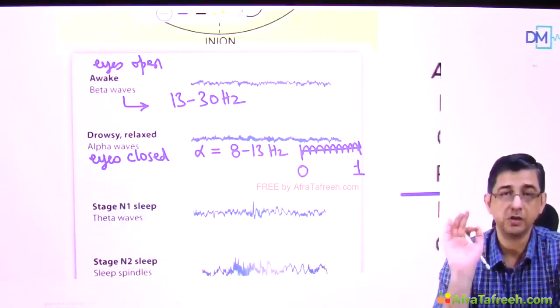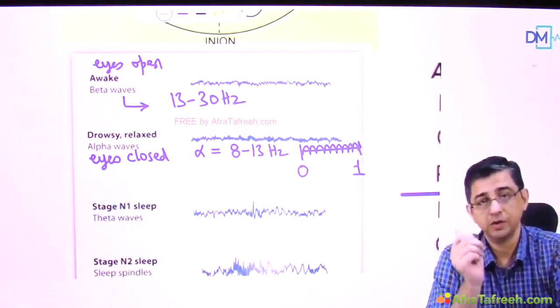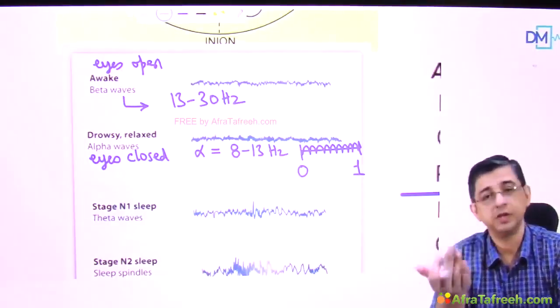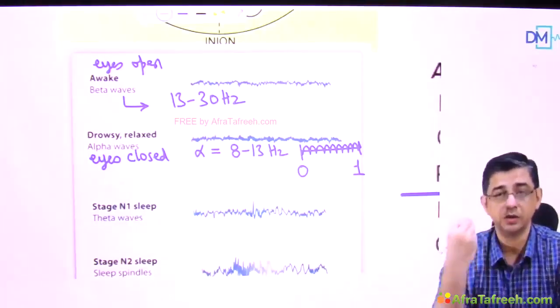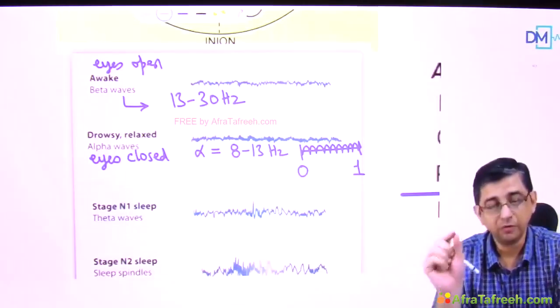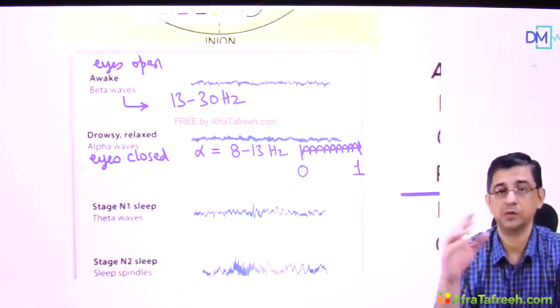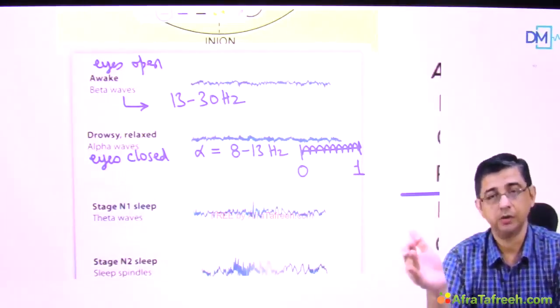Like for example, in focal seizures, majority of the time EEG turns out to be normal. I mean, a person who's having focal seizures, lots of time, he might come to you and say, sir, my EEG is normal most of the time. Because focal seizures usually occur in conditions like neurocysticercosis or mesial temporal lobe sclerosis. There are some focalized areas in the brain which are having fibrosis and associated electrical abnormality, so their EEG can be normal in between the discharges also.